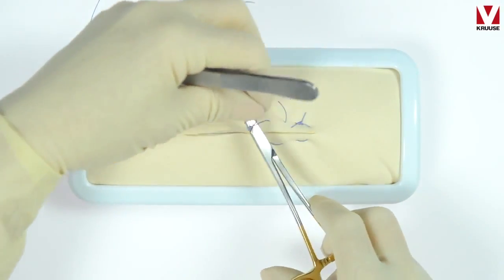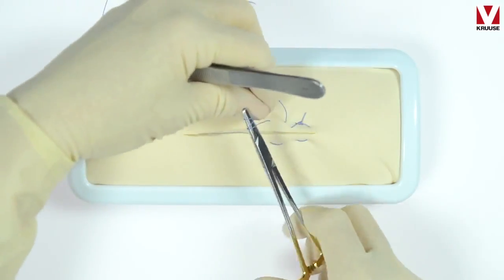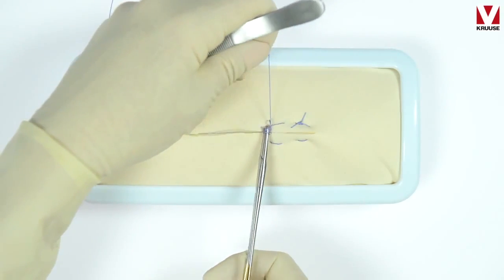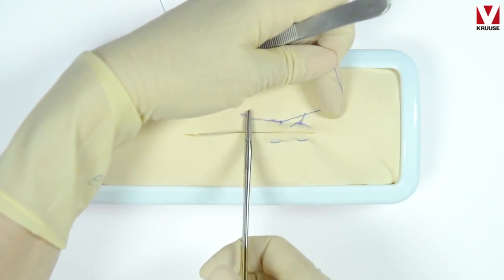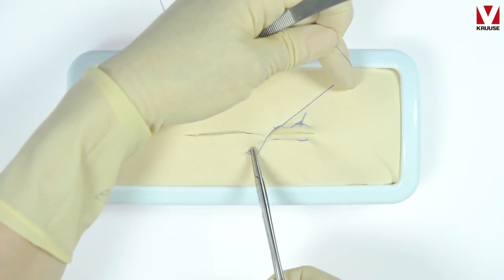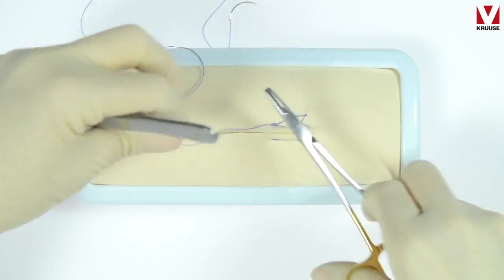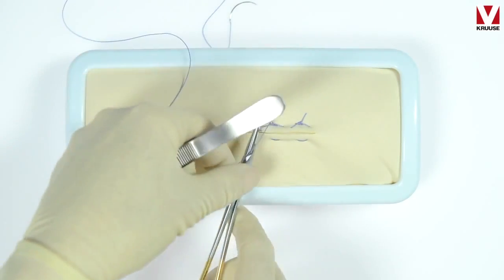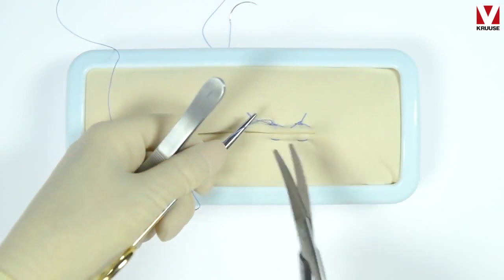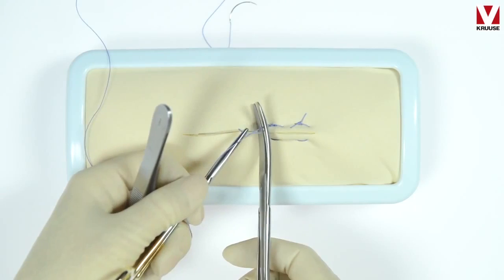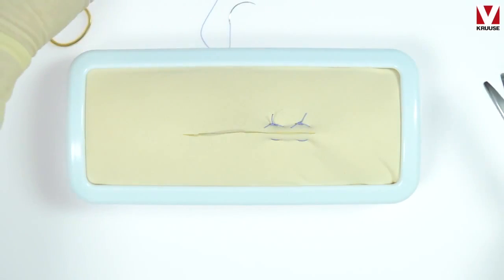It makes it easier to tie the knot without the suture slipping. You see here that this is an everting pattern. When you remove the stitches after healing is completed, the everting pattern will disappear and will find its right position.